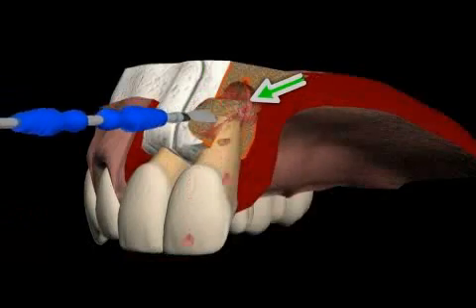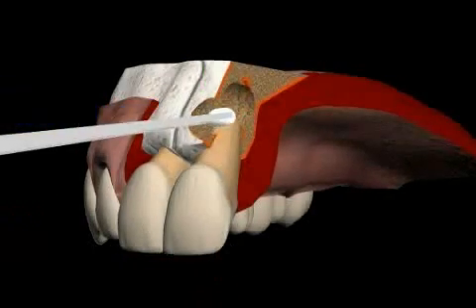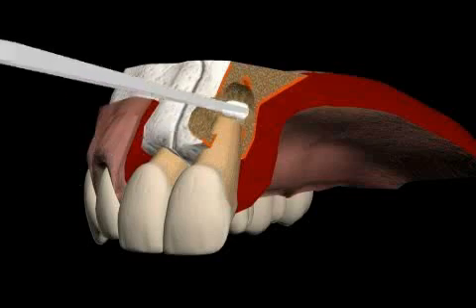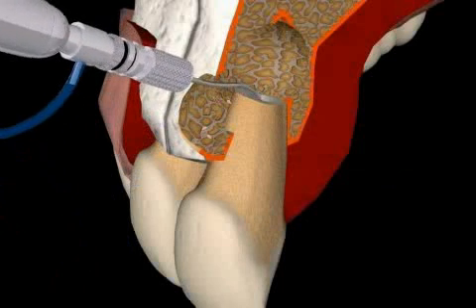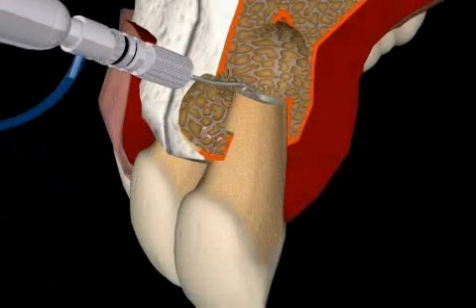You see the infection on the root tip and there is still no bone formation. Granulation tissue is removed and a medication to stop bleeding is inserted. Now, the root is conically refurbished from below using special instruments. The pink parts are remnants of the old root canal filling.